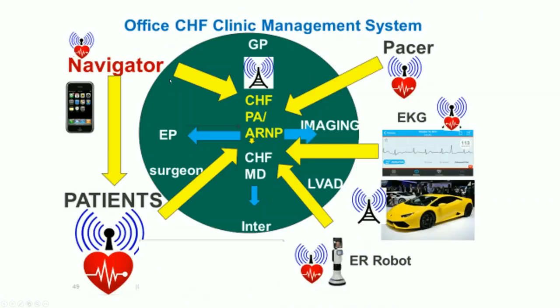So as we develop this management system, we seem to be getting more and more connected electronically. Here's a connection electronically. This is with something that's an EKG or an ECG. It's an app on your phone, called a LiveCore or a Live ECG.